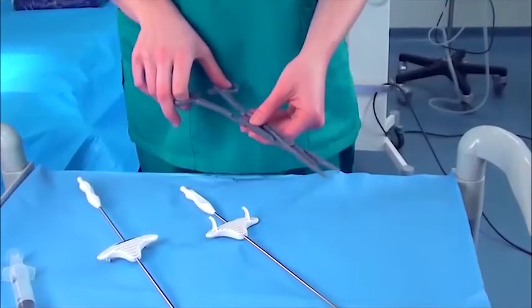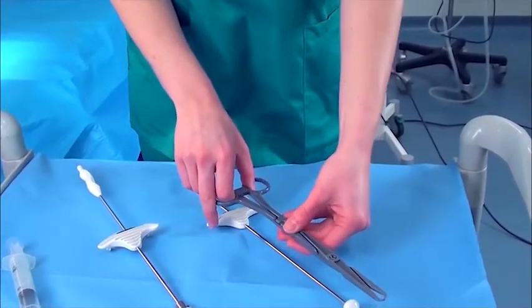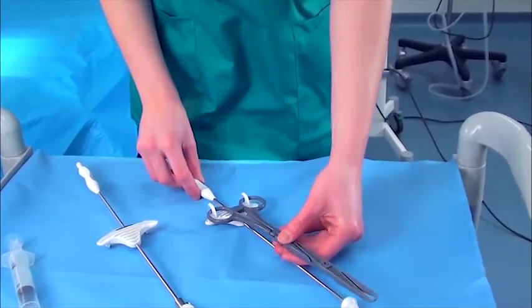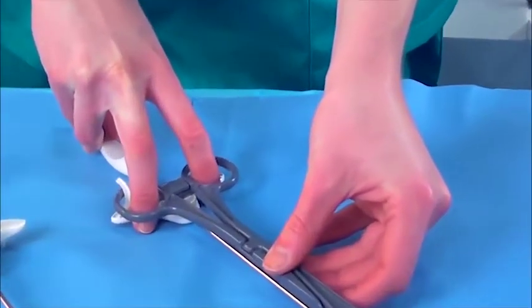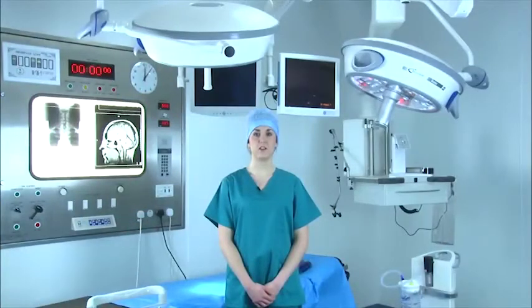Directions for use are simple. Firstly, sound the uterus for depth and direction, then apply the tenaculum to the anterior lip of the cervix and pull back onto the tenaculum hooks. Next, pull back the self-locking clamp to apply pressure, thus creating a tight seal of the cervical cone on the cervix.